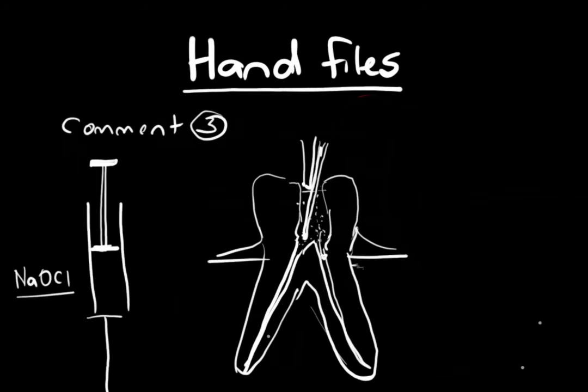So you can end up with copious bits in yellow here, chips of dentine and amalgam or composite, whatever is there, and they just clog up the canal, and the canal can become blocked out very quickly.